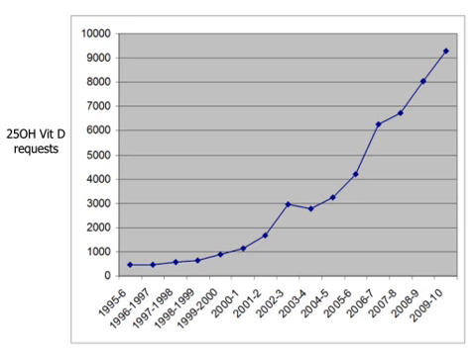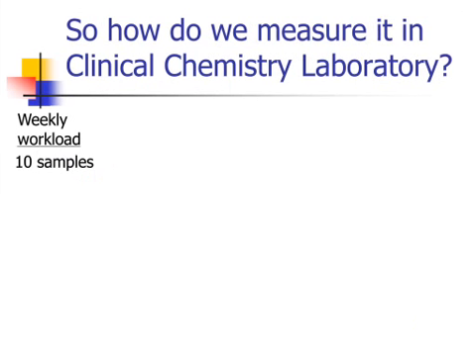And we're not by any means a high vitamin D lab. There are labs that do as many as thousands a day. So it's quite a lot. And that has fairly large implications for a clinical chemistry lab because vitamin D is not a particularly easy thing to measure. It's bound quite tightly by a binding globulin. There are metabolites that can mimic it, so immunoassays can struggle sometimes.